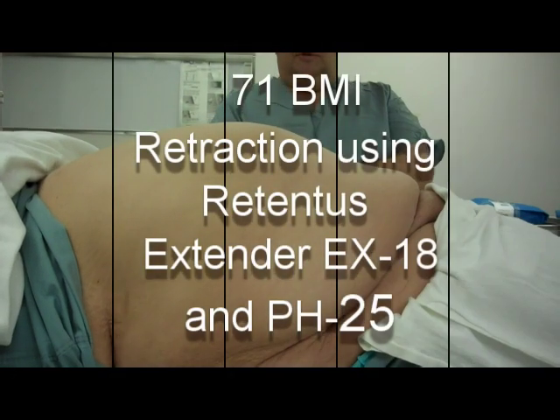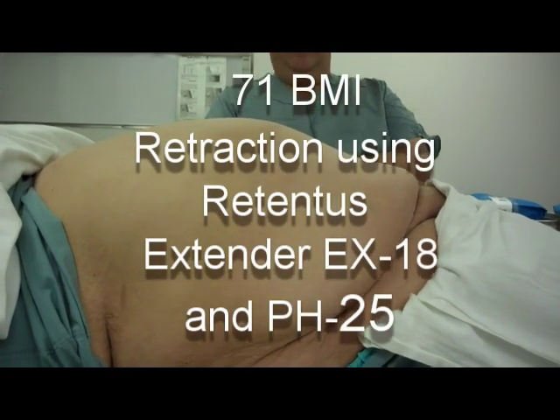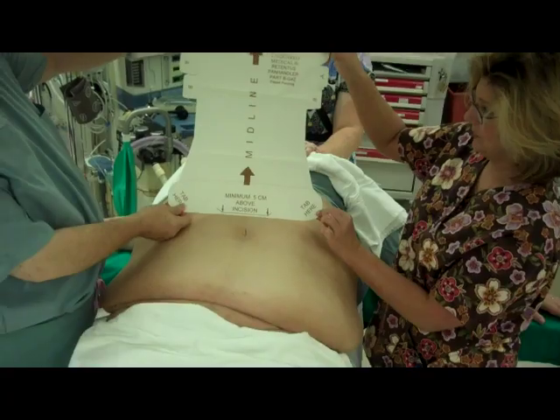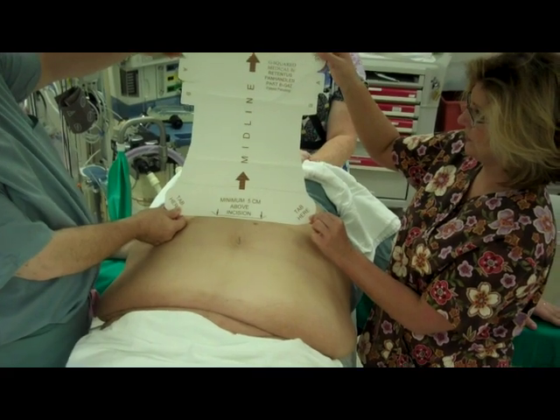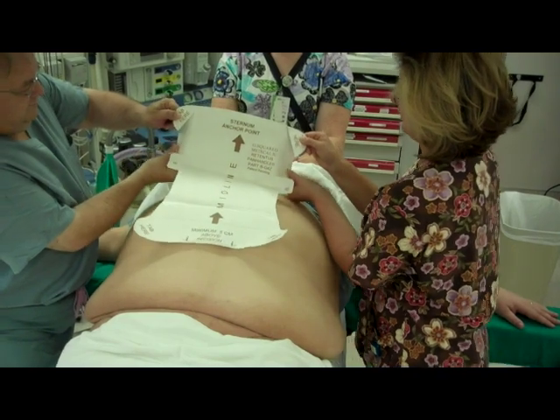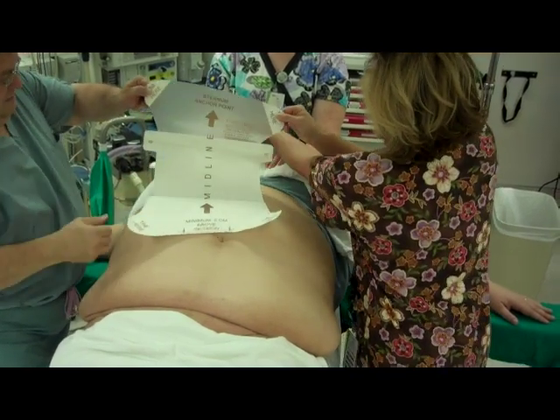BMIs greater than 50 may require the use of the Retentis extender in conjunction with the pH 25 to achieve optimal retraction. Use the extender to expand the anchor point. The combination of the two devices will yield optimal exposure to the surgical site on BMIs over 50.